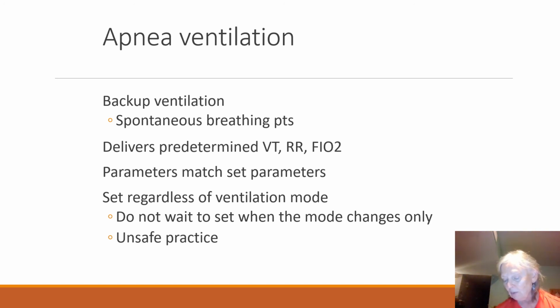Check those settings. There's been instances where people have not checked the apnea backup settings. They documented that they did. A case in point, some hospital, there was a lady who had really bad lungs. Her set tidal volume was 300 mLs. Nobody looked at the apnea parameters. That apnea backup was set at 900 mLs.